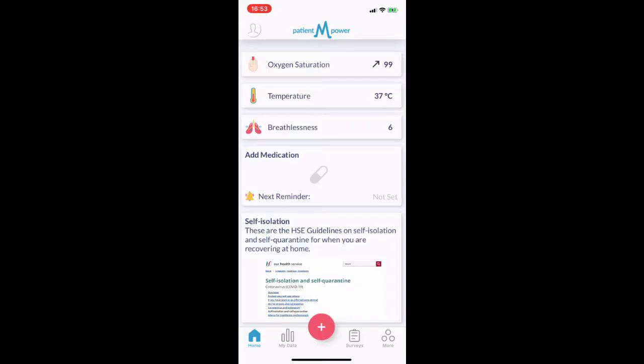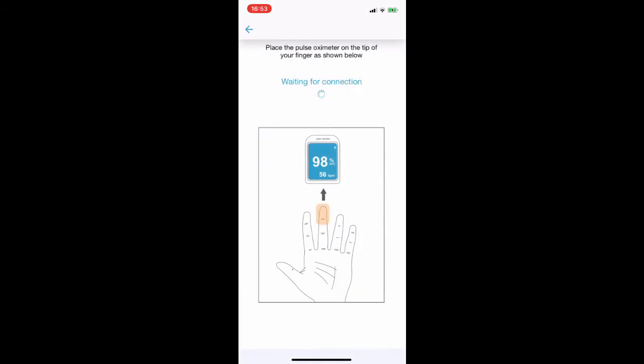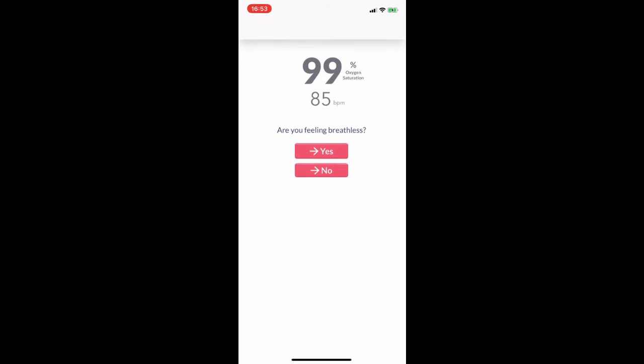Press the plus button at the bottom of the screen and then select add pulse ox. Place the pulse oximeter on your middle finger as indicated in the picture, palm facing upwards. If you are feeling breathless press yes, if not press no.